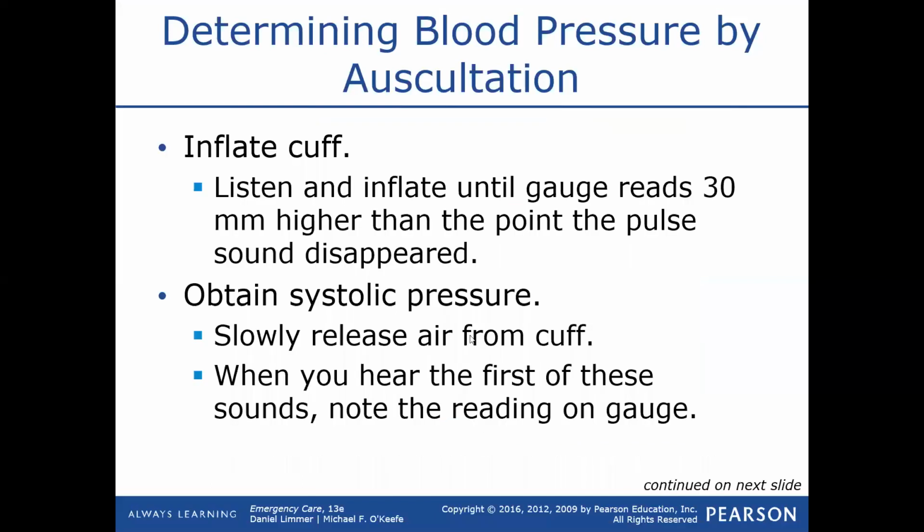All right, we're going to inflate the cuff. So now we're going to start squeezing the bulb. And we're going to listen and inflate until the gauge reads 30 higher than the point the pulse sound disappears. So now we're listening with our stethoscope. We're hearing the pulse, okay? We want to squeeze that cuff until we don't hear a pulse anymore. We're actually cutting off circulation in that arm temporarily.